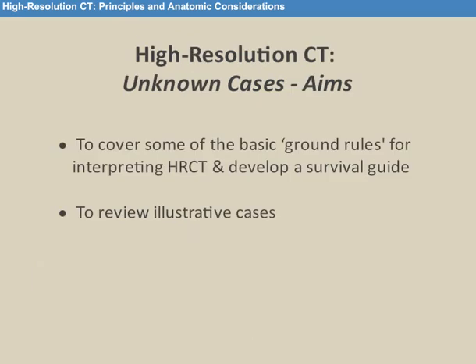Now, what I'm going to do in this next 26 or so minutes is to cover some of the basic ground rules, because I think even as chest radiologists, we have a system when we look at HRCT.